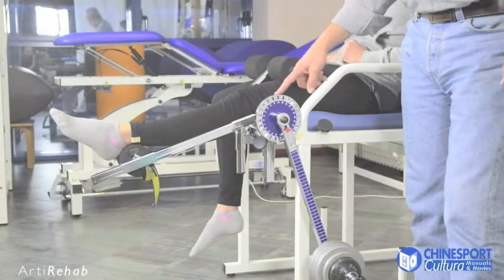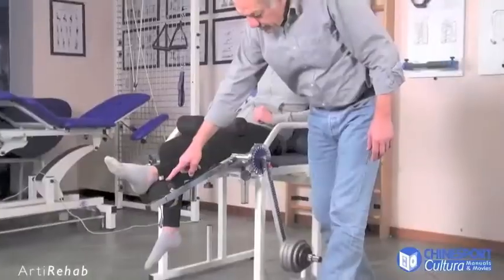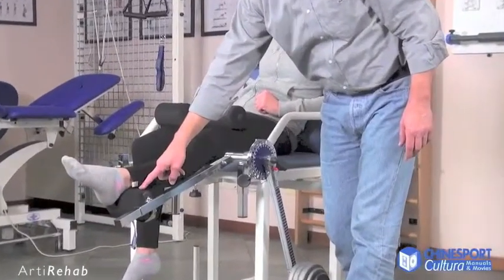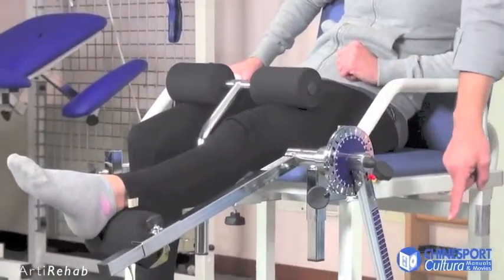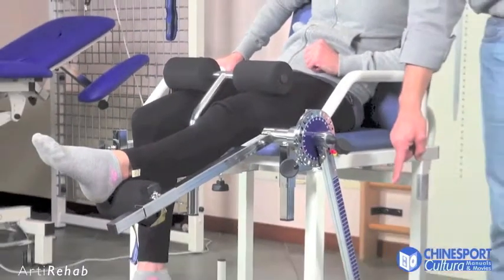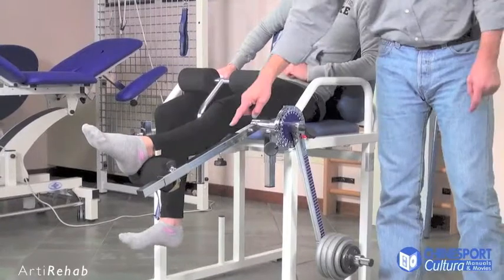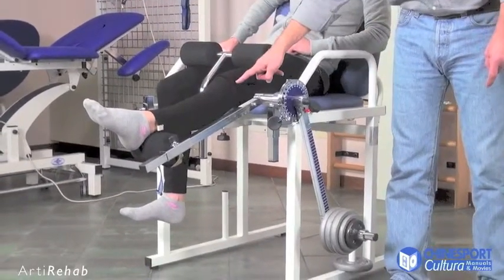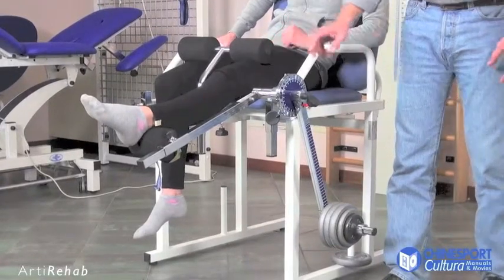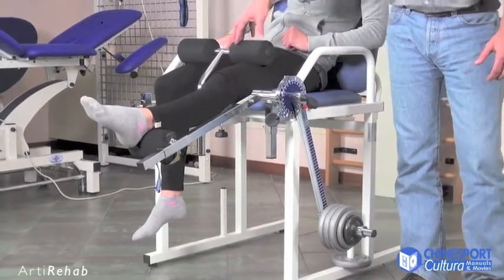Arty Rehab can also be used to do passive extension exercises for the knee. The back of the ankle of the foot is put on the thrust arm cushion and a weight is hung from the loading arm. At this point, the counterposition of the angles creates an upward tension on the thrust arm, which is transmitted to the knee, extending it passively due to the block put on the thigh on the machine's chair.